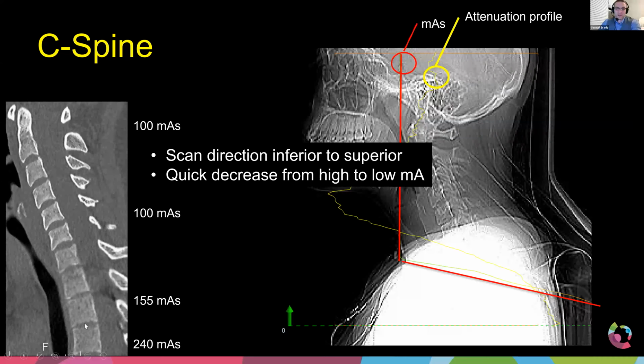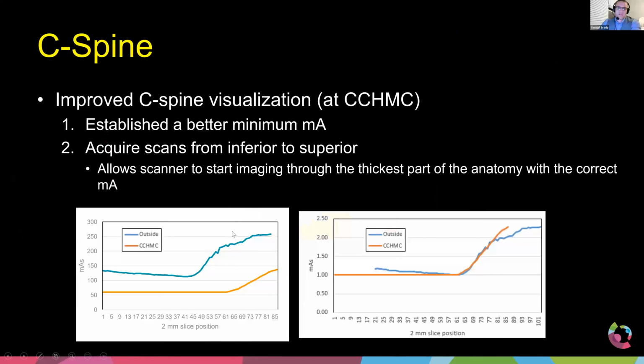This is a thicker patient, and so the vertebral body was still very well visualized. There was maybe a little more translucence in nature in it, but still, artifact-wise, it's much, much better than it had been. And so, all right, sorry, those slides are out of order.